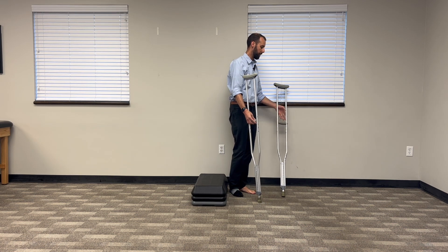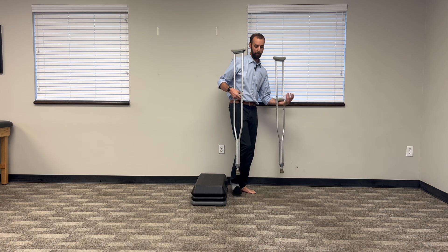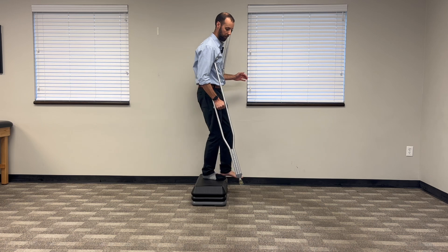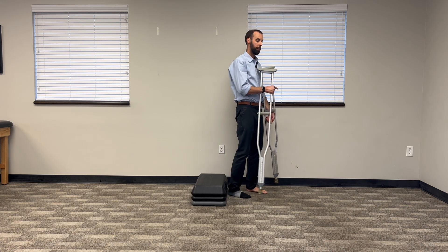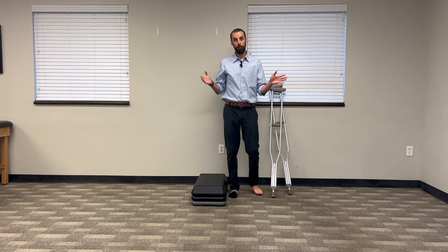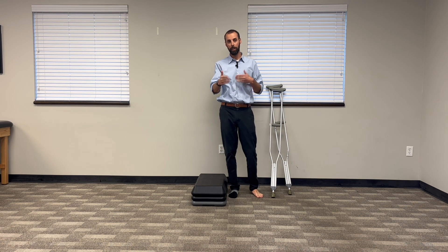If you're using one crutch, you can carry the other on your forearm. That'll free up a hand to use a railing if you need to, and just hold one crutch and go down like that. Up with the good, down with the bad — and that's it. That's how you do it. It takes a little bit of practice, but once you get the hang of it, it's no problem at all. Let me know how it works for you. If you feel safe and comfortable, make sure you check out that other video to learn how to walk and how to size those crutches just for you.